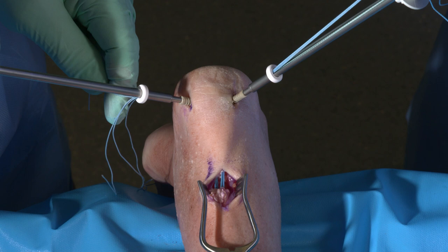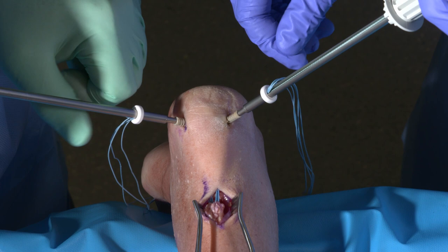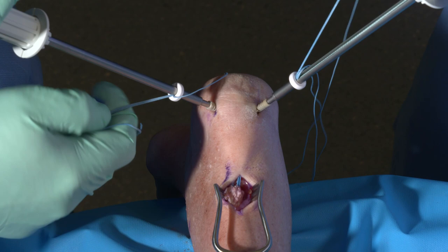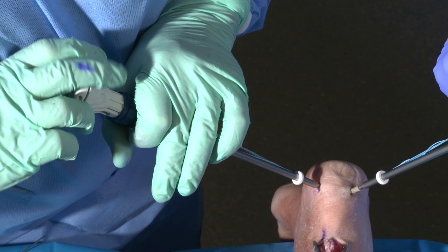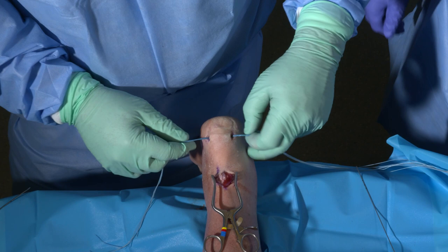The strands of suture can then be individually tensioned to close up the tendon gap. I like to perform this sequentially, pulling on one strand at a time. With this, you can notice that the strands of suture will start to come together and close up the tendon gap. The device also has precise laser markings to ensure that the correct depth is achieved. The delivery system is removed and the tails of the suture are trimmed flush with the bone.